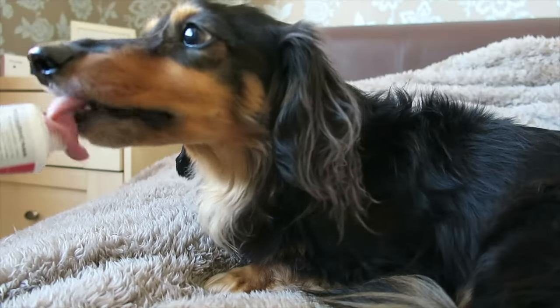The first thing you want to do is get a scaler. There are a couple on the market. I have one with a flat edge on it rather than a pointy one — I find these work quite well. You also want to get some treats; maybe you could use the toothpaste that you use with your toothbrush as a treat as well. Get your dog nice and calm and settled ready for scaling their teeth.